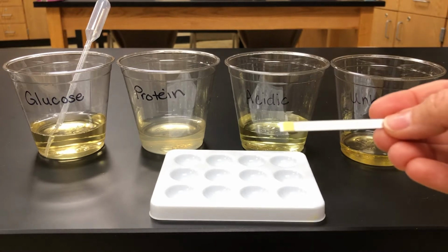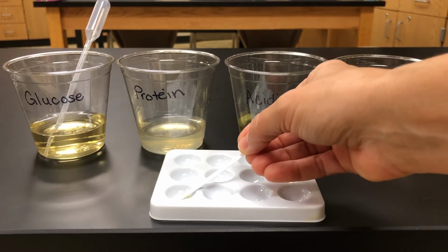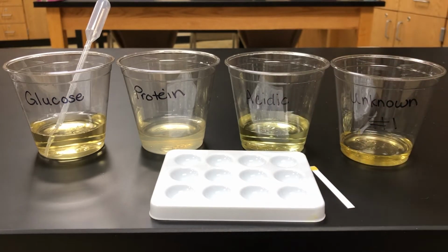Okay, so here is my test strip. You can see the little pad on the end. I'm going to place that in the urine for a couple of seconds, get the excess off, and we're just going to let it sit there for about 2 minutes. Okay, we can move on to procedure number 2 while we're waiting for that.